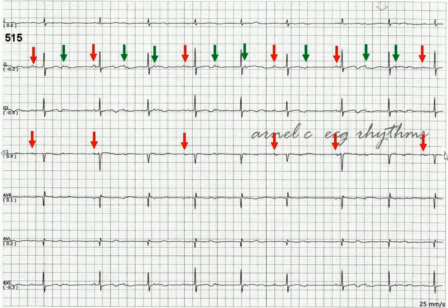Now let's search for the P. If you have read other blogs or the works of Dr. Henry Marion, then you have read the French term of searching for the P, Cherchez Le P. Searching for the P in one lead is not good. So I print them in full disclosure, all available leads, and look at the P wave in simultaneous leads. I mark the obvious P waves in red, and the not so obvious P waves in green. The PP interval is about 18 small squares, or about 83 beats per minute.